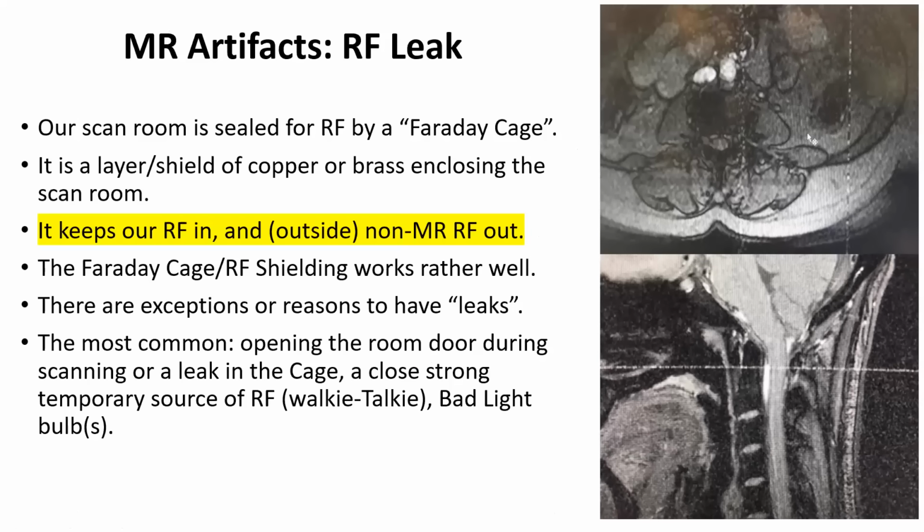Okay, what's another common artifact? This happens at my place all the time. And it's not that we have a bad Faraday cage. It's just that the techs at my place think nothing of just blasting into my scan room while I'm scanning. That's a pet peeve of mine.